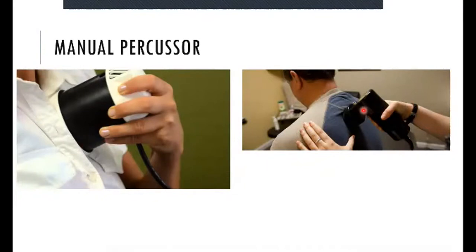This is a vibrator here. You hit the button and it vibrates real hard, okay? It's almost like a massager. But it vibrates so strongly sometimes that you can't even hold it. It's hard to hold because your hand gets feeling funny and numb, right?